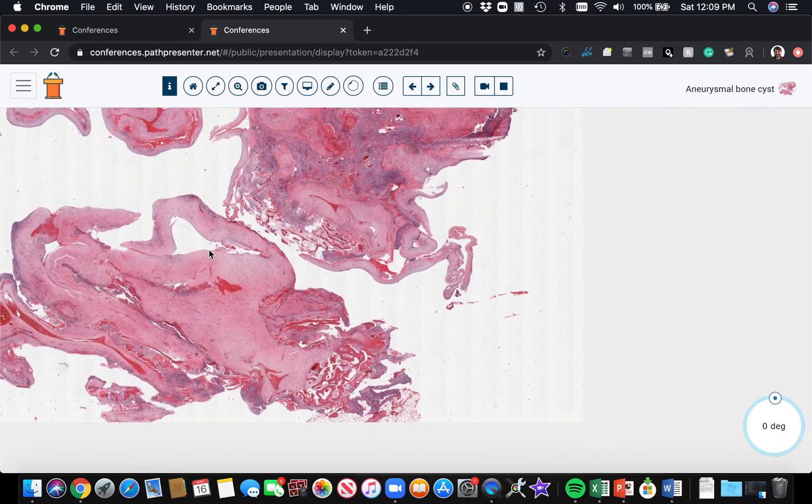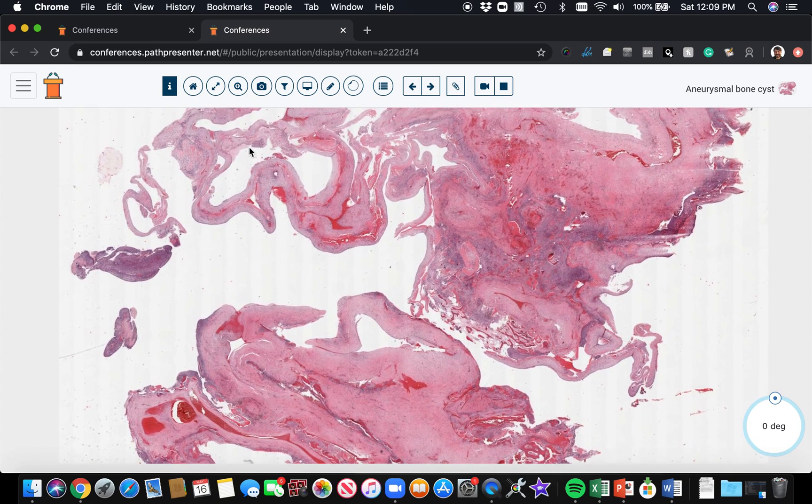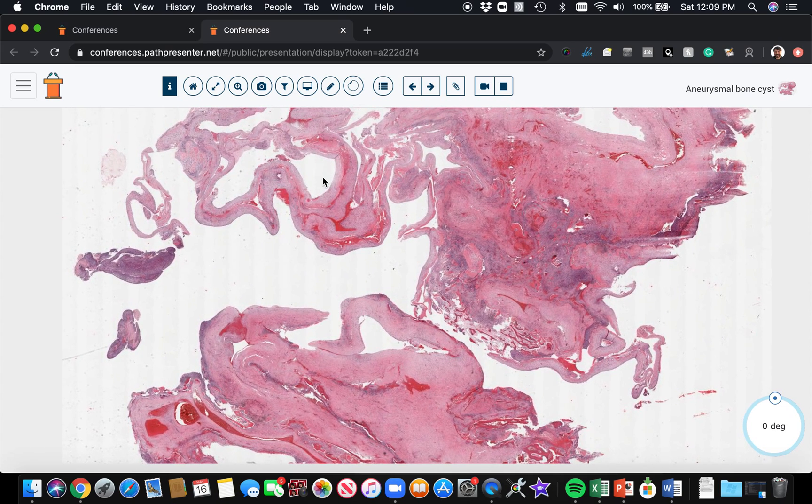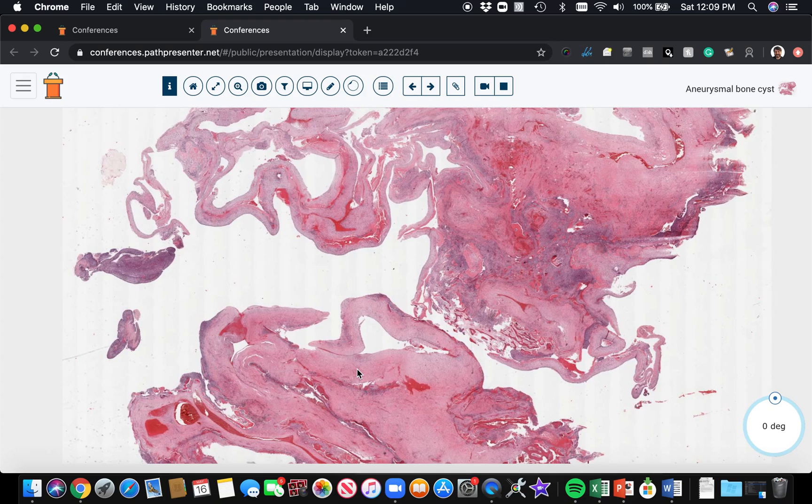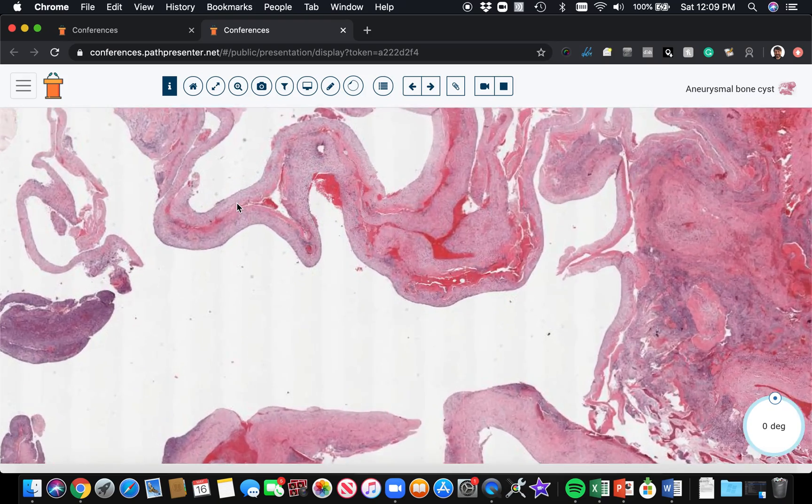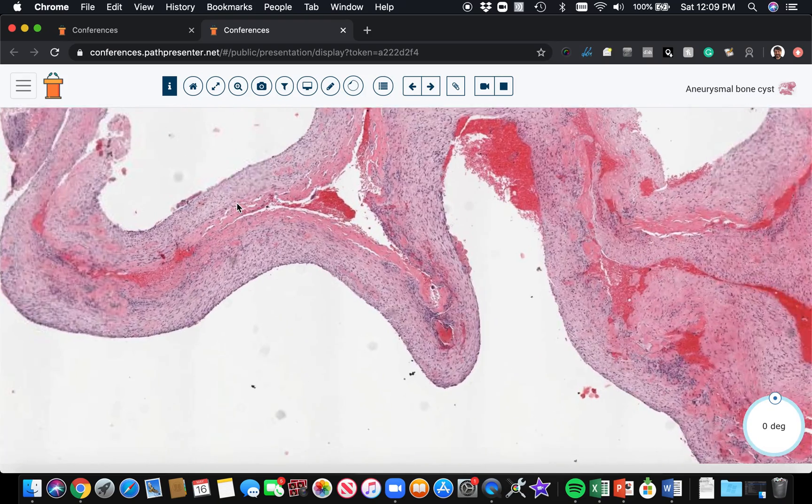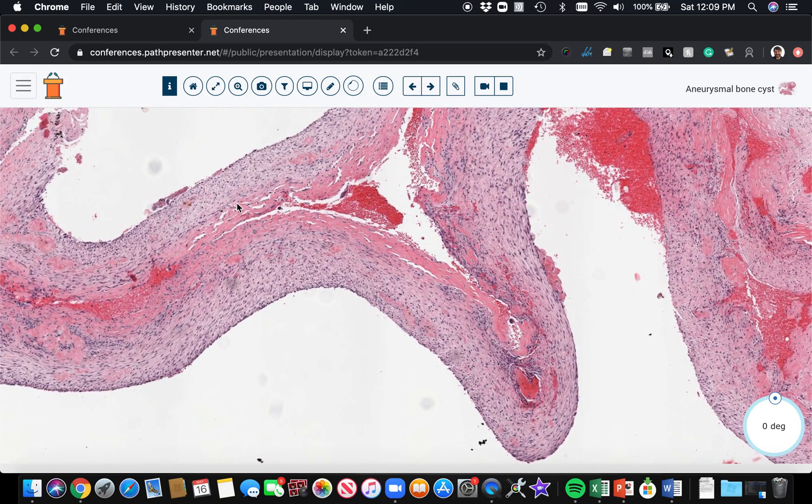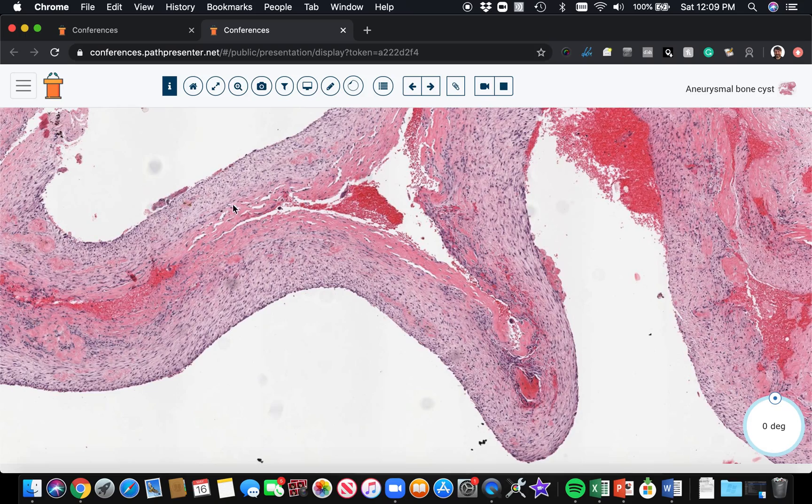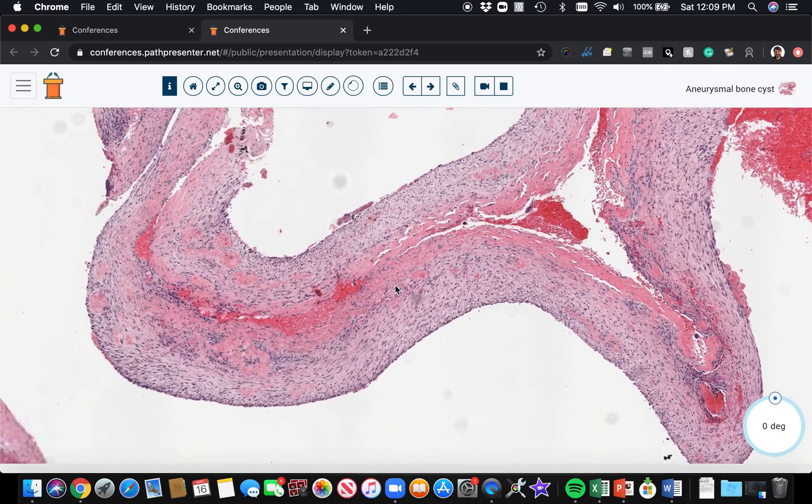So blood-filled cystic spaces - again the blood's often washed out, but you'll often find hemosiderin and little pockets of hemorrhage retained. The walls of the cystic space are composed of kind of loose fibrous tissue with a kind of edematous background.